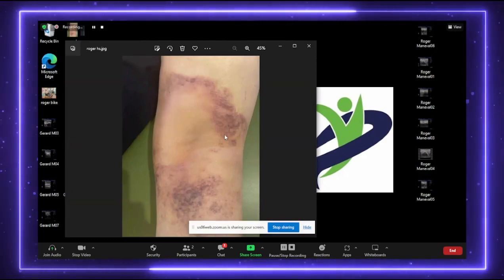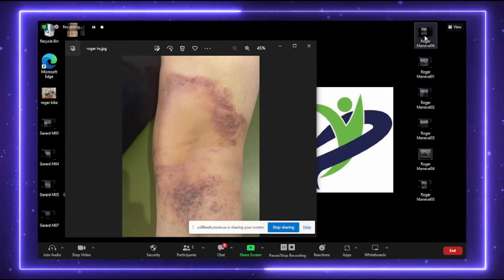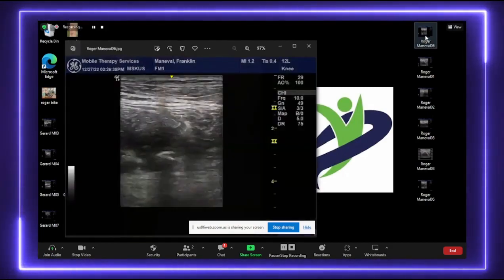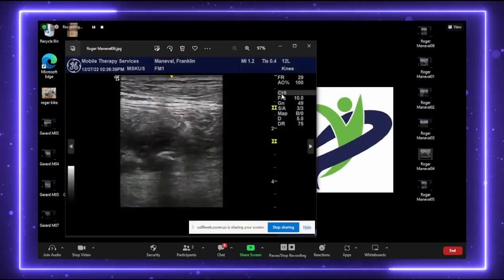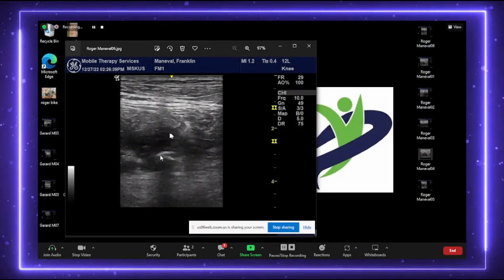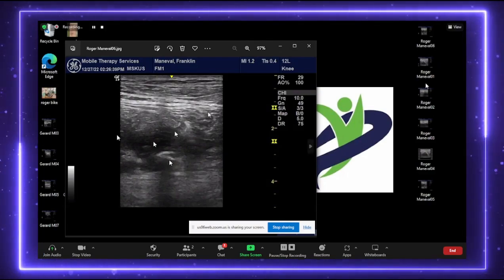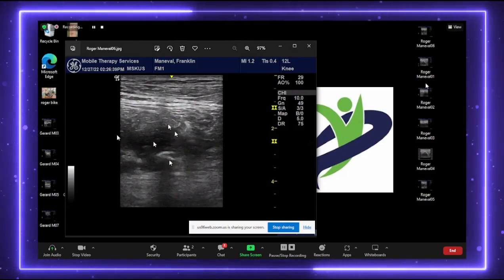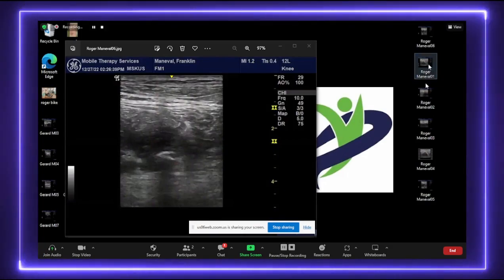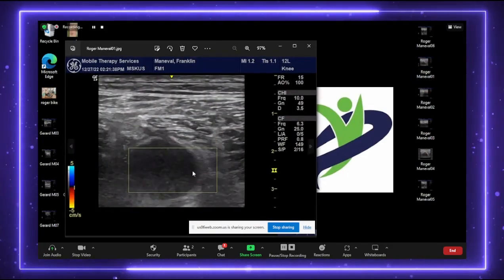I said, wow, I've never seen anybody rupture a hamstring. I said, well, why don't we take a look? So we start scanning them. So I have some images here. So this is a short axis view of his semitendinosus. There's a fragment of avulsed bone that peeled off from his ischial tuberosity. This is where that semitendinosus would be residing, some of the conjoined tendon above. Here's where the semitendinosus would be.